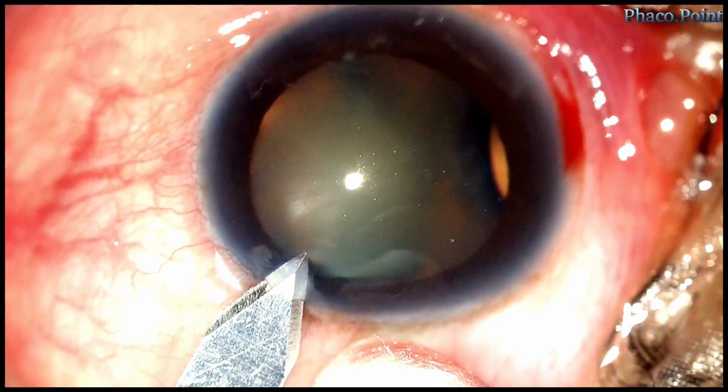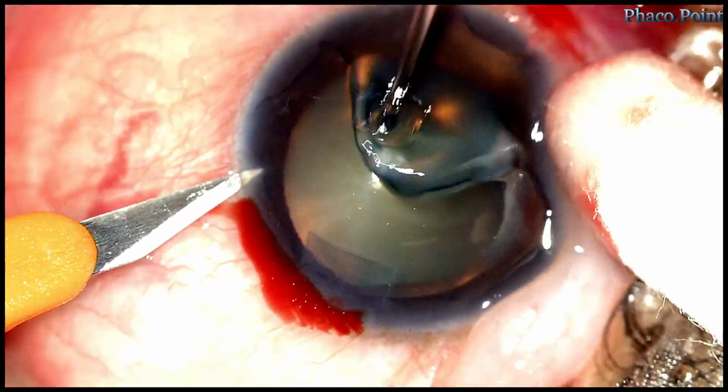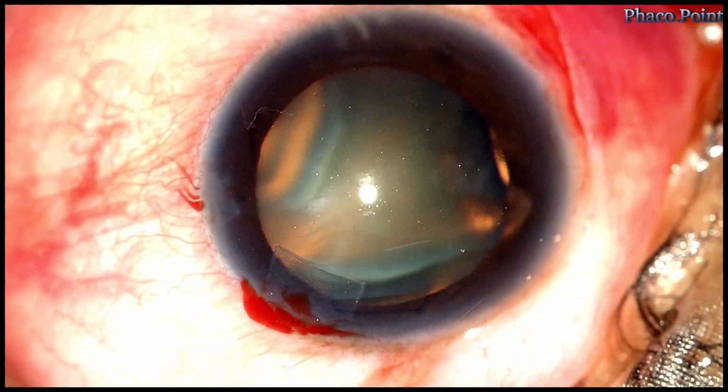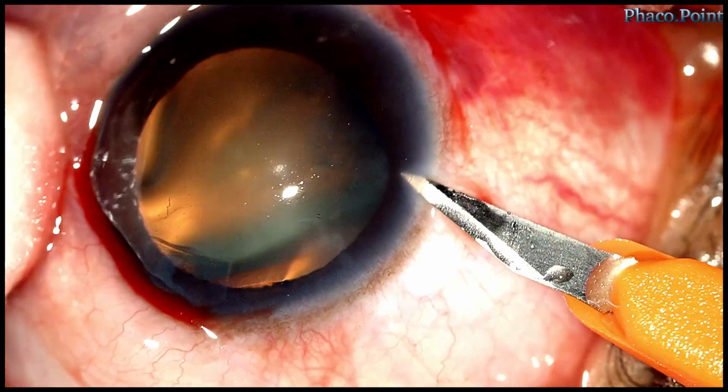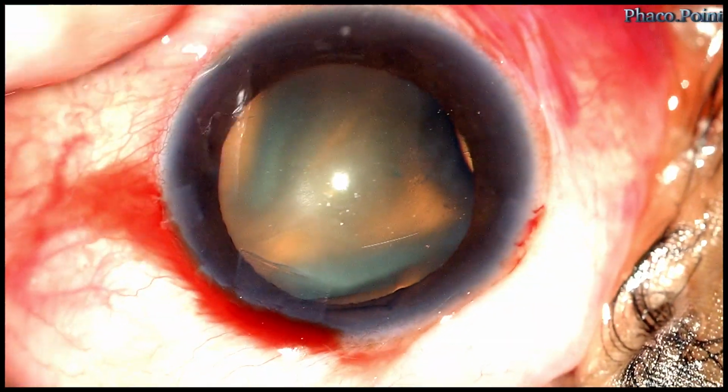Meticulous care and attention to detail are taken while creating the incisions. And this is important because in a compromised case, you don't want any difficulty during instrumentation in and out of the eye during the surgery.